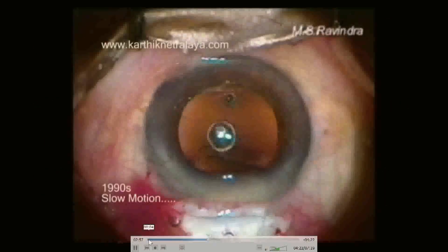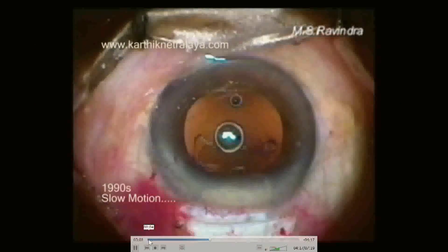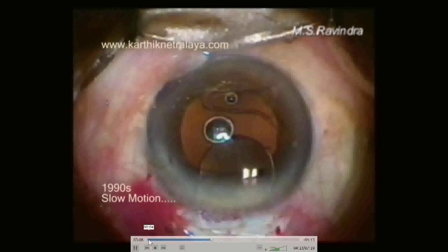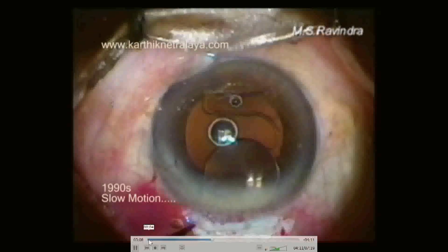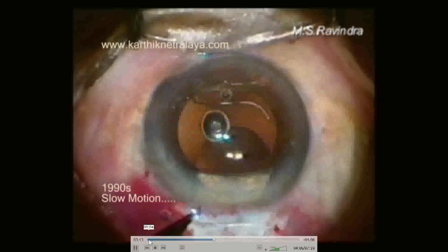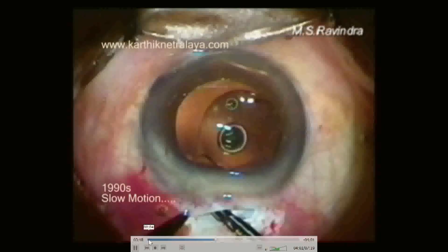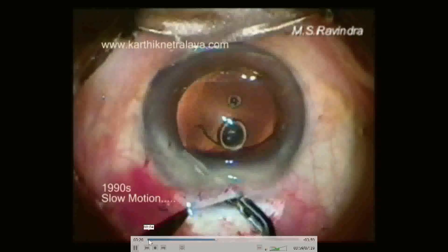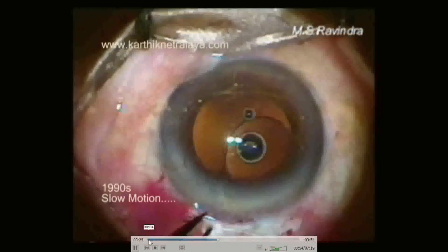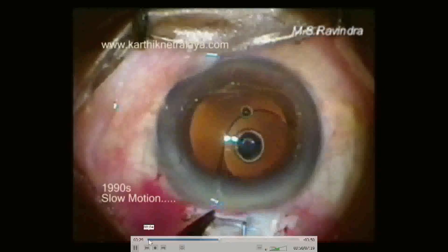So that is the status where we have done a vitrectomy. We have lost the capsule and the lens is very carefully guided within the viscoelastic so that the leading haptics go and impinge upon the anterior, distal angle. There are two ways of implanting it: either hold the haptic and then push it, or it can be very gently inserted using a T-dialer. The T-dialer pushes it and each trailing haptic is inserted into the angle region.